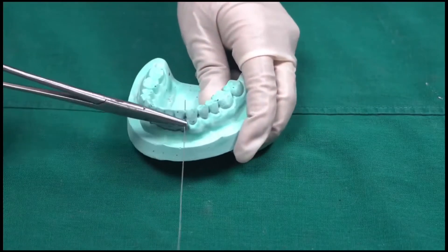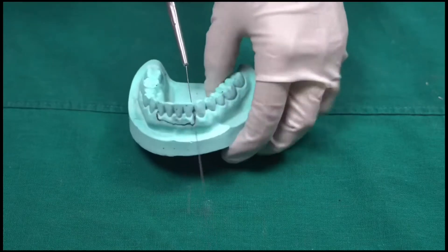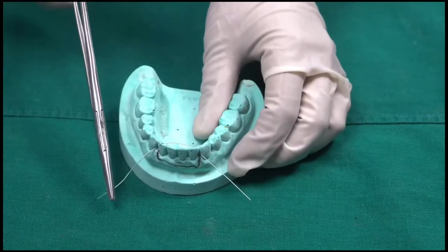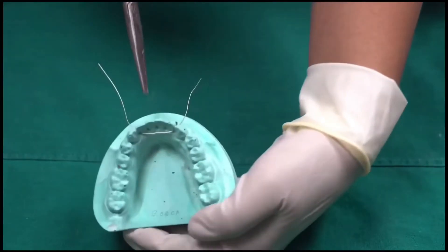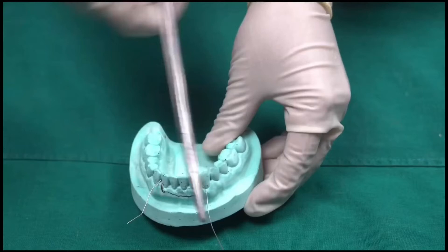Now let's start with wiring. Pass a wire in the neck of the chosen tooth. The initial wire will pass from buccal to lingual, and then again from lingual to buccal side. This will be named as your lingual wire, and this is your buccal wire.